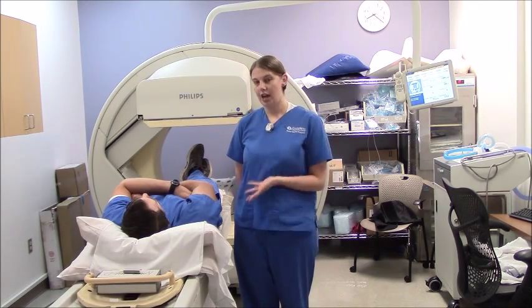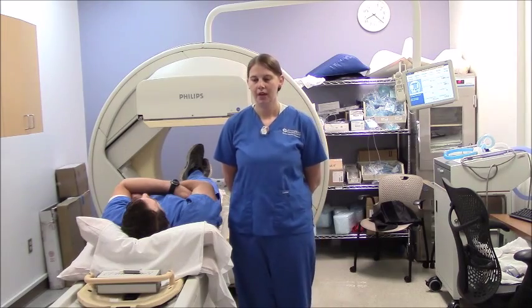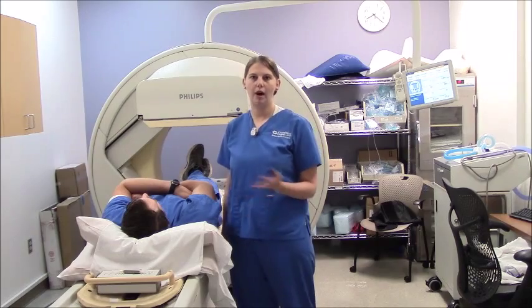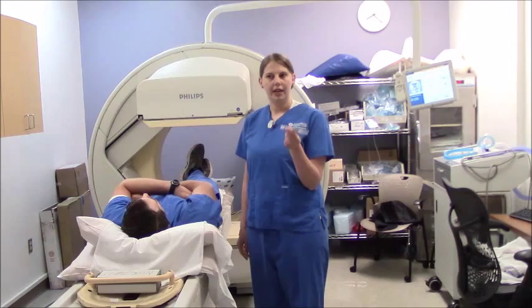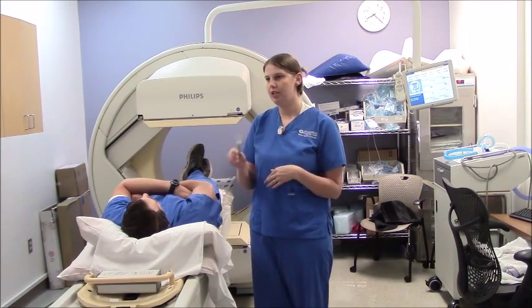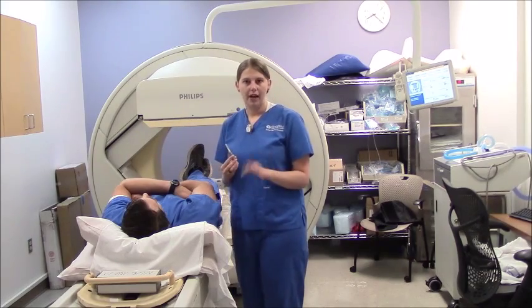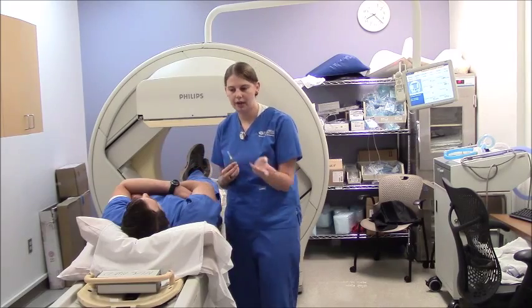I have my patient Jake here, who has just completed his ventilation portion of the test. So now we'll move right into the perfusion. As you can see, the patient is still supine. You want them to be laying down while you give them the injection. It's a small amount of a radioactive tracer. It's actually very small particles, so you want to make sure and agitate the syringe before you inject it. You'll inject it through a butterfly needle or an existing IV line in the arm or hand, whatever's accessible.